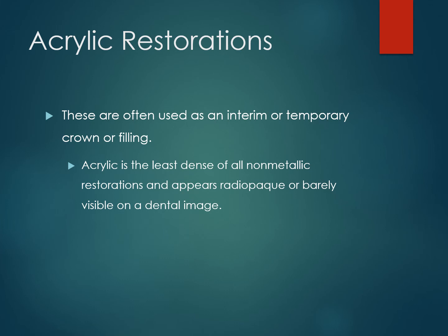Especially if you've been an assistant or ever had a crown placed, then you know that when they prep a tooth for a crown, they shave off the enamel and leave just a little stump or post of the tooth. It's just the dentin and then the pulp is inside there, right?